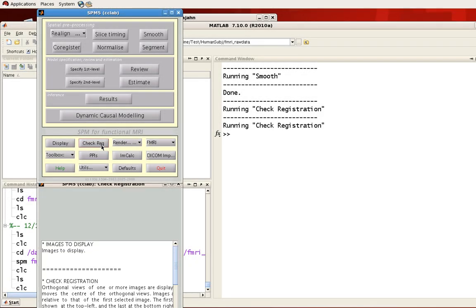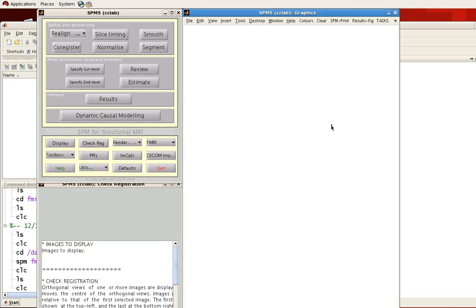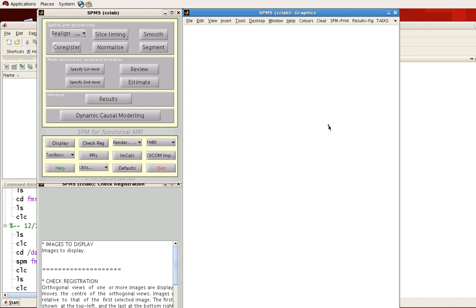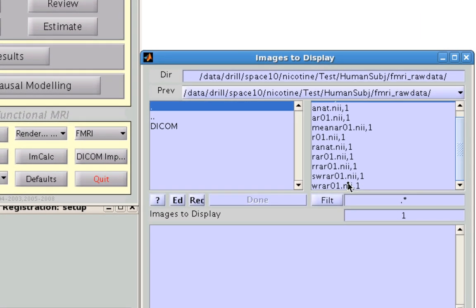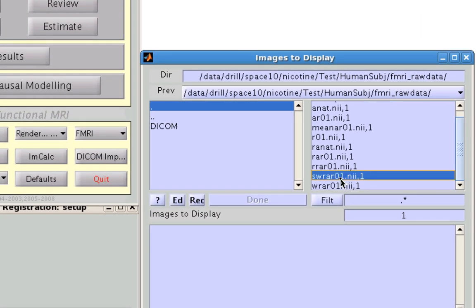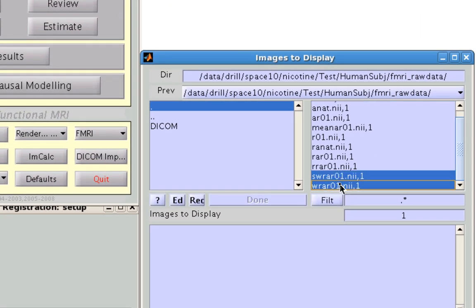Once smoothing is completed, click on Check Registration to check your smooth images. Here I'm going to compare our smooth images to the images from the previous preprocessing step.